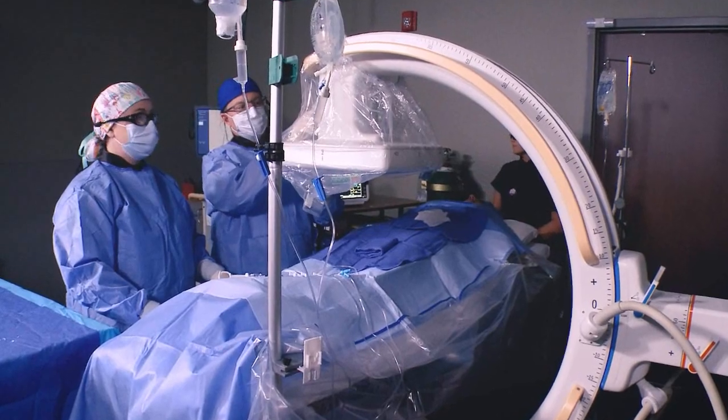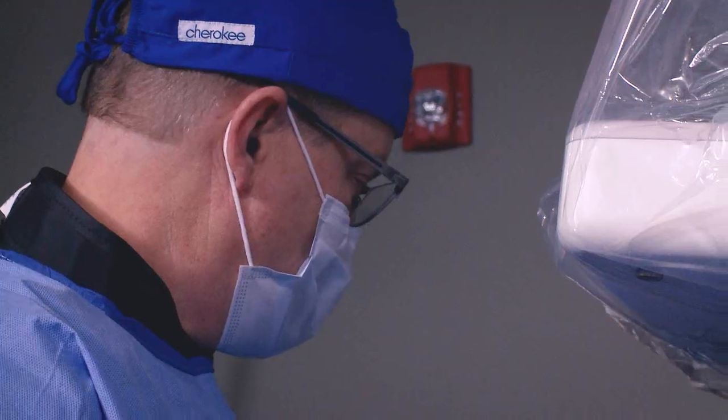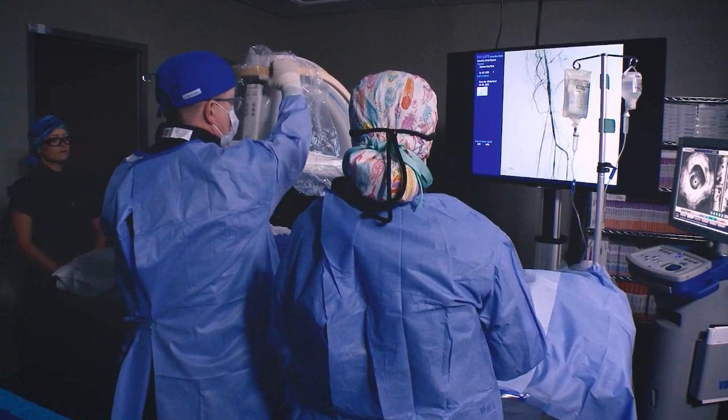The driving force in getting us to choose the Veradius was the partnership with Philips and the support that we received. Probably the most important feature is the small footprint and its ability to deliver superior image quality.